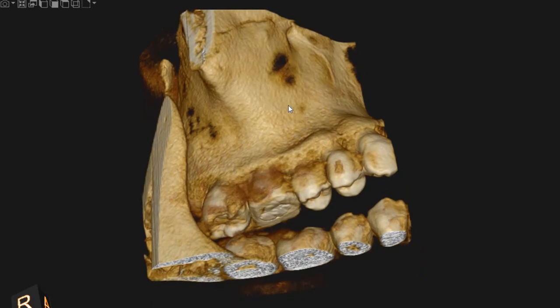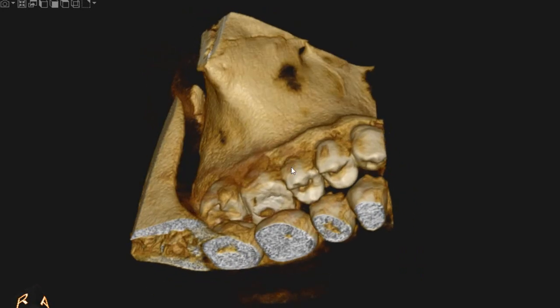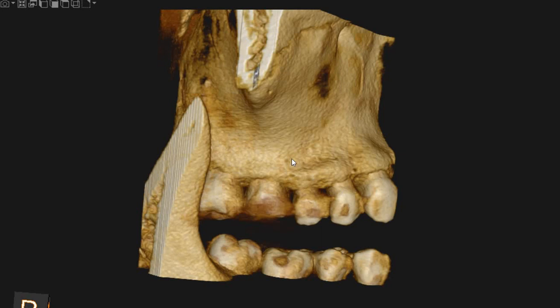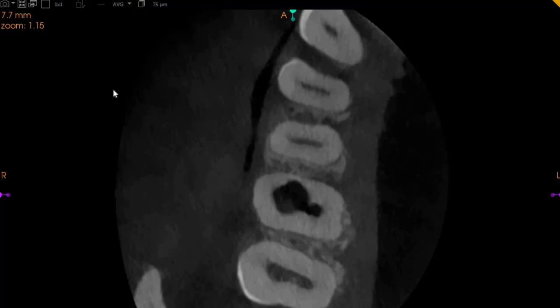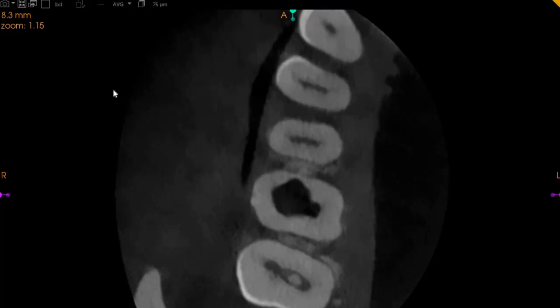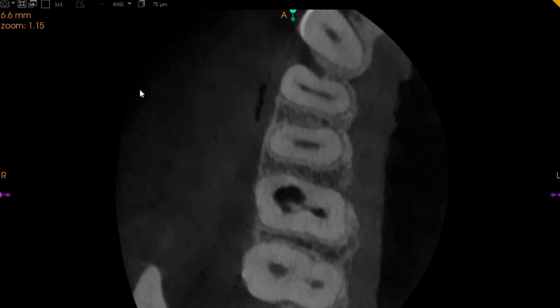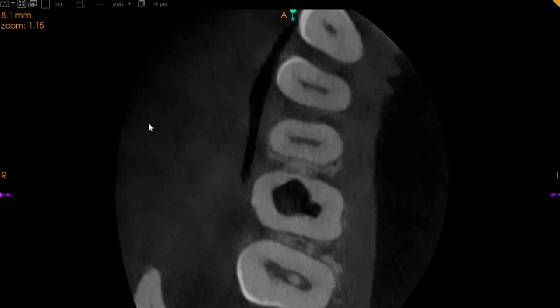Hello and assalamualaikum. Ultra Scan Diagnostics here. This is the CBCT of the patient who had requested — the area of interest is the upper right six, and the doctors asked for our evaluation of locating the MB2, cracks, or any missed canals. This is the axial view, one of the most common and most informative views when it comes to canal location — we're looking at the top-to-bottom view, and this is where the chamber opening is.